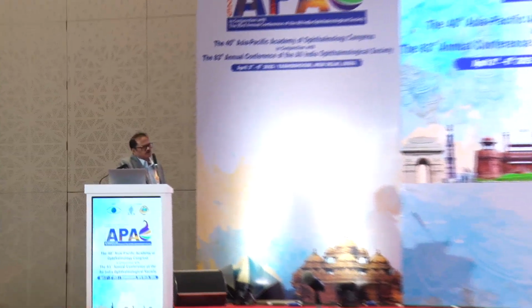Sir, actually, we expect that there will be some amount of error. By definition, refractive surprise is when you have 0.75 diopter of astigmatism after surgery or 1 diopter of spherical error after surgery. So, I could not get your question, how much you?